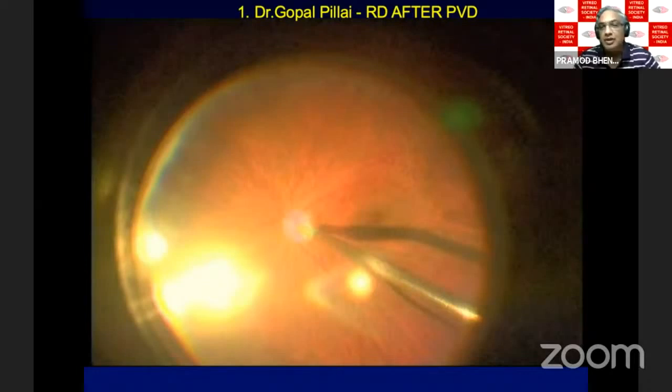When you induce the PVD, you follow that edge of the vitreous separation on the retina. You see that edge-like thing, and where you feel there's an excess tug, you should stop there and just cut rather than allowing suction to proceed further.